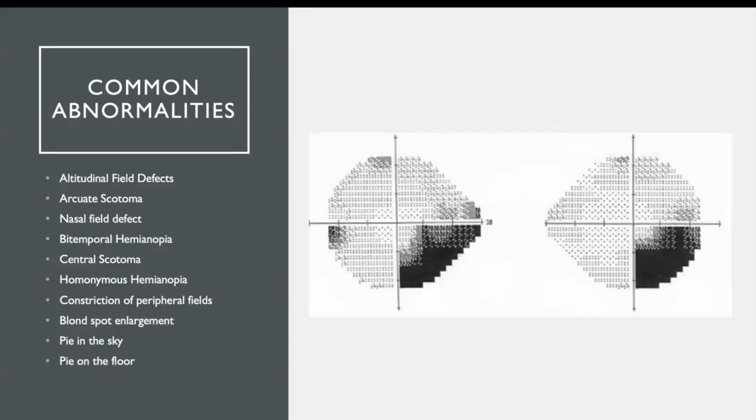So if you're looking at peripheral retinal lesions, if you've got lots of laser, if you've got lots of scarring, you can kind of guess where the field defect is going to be. If something is in front of your chiasm or behind your chiasm, again, you should be able to start to guess where these field defects are. So use the field test as a confirmation, and B, it can be very helpful, obviously, in monitoring chronic disease as well.